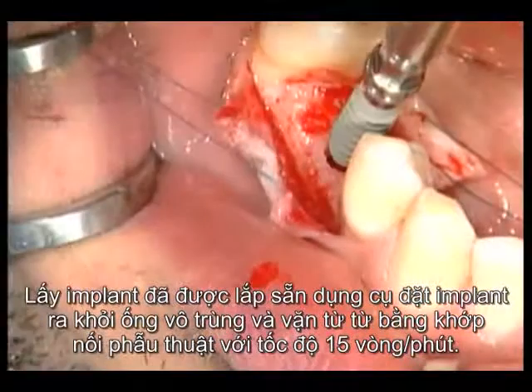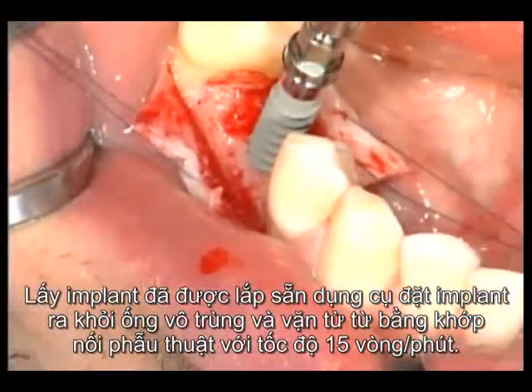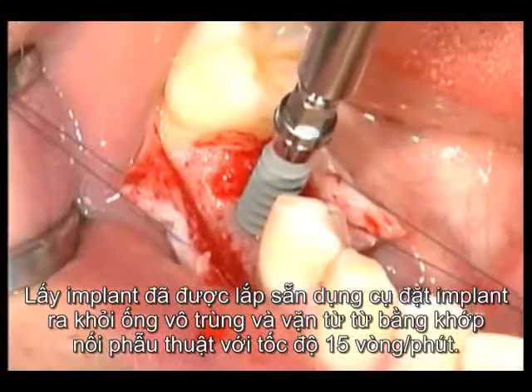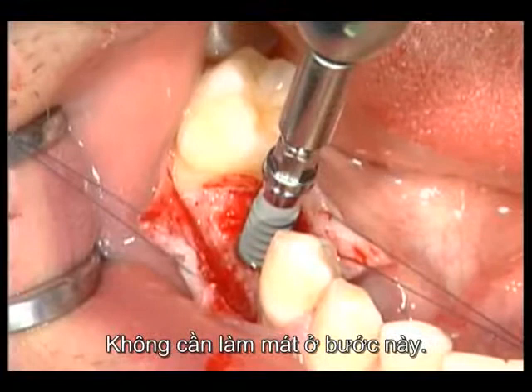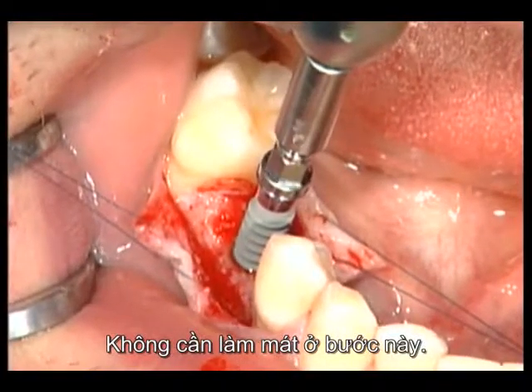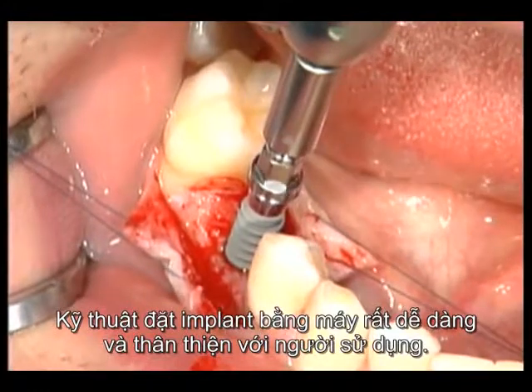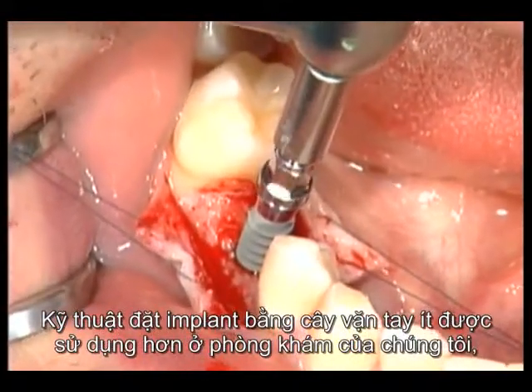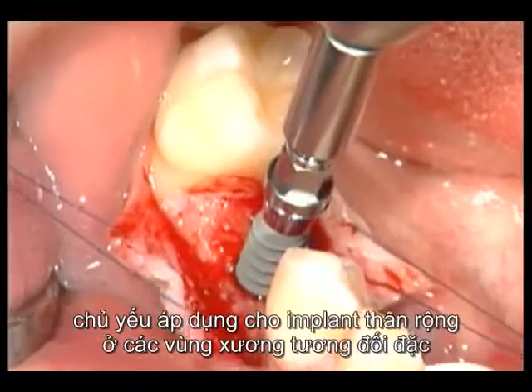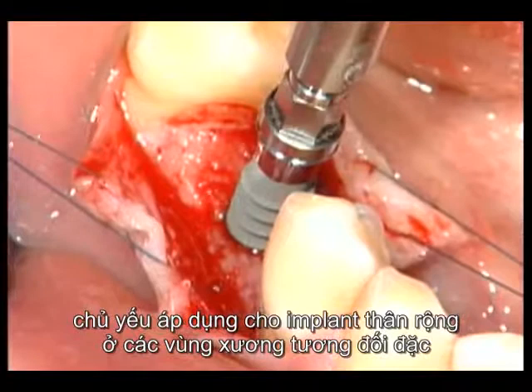The implant with a pre-mounted insertion device is removed from the sterile ampoule and slowly inserted with a surgical adapter at 15 RPM. No cooling is required here either. This technique is very user-friendly and easy. The alternative manual ratchet technique is less frequently used at our clinic, and then mainly for wide-body implants in rather dense bone.